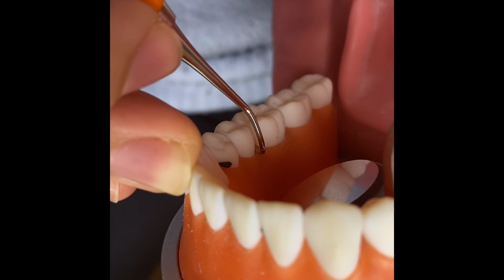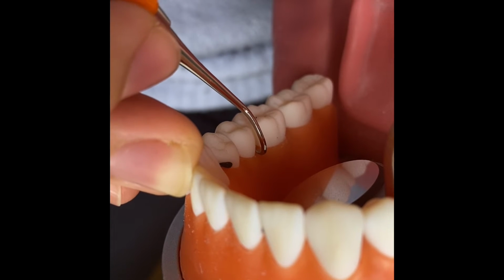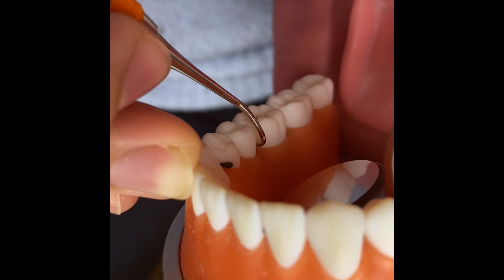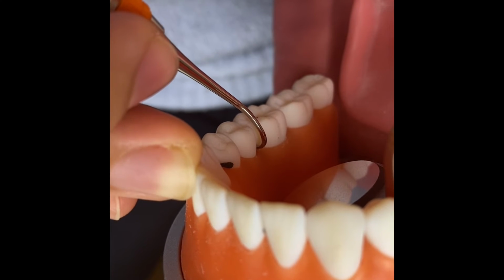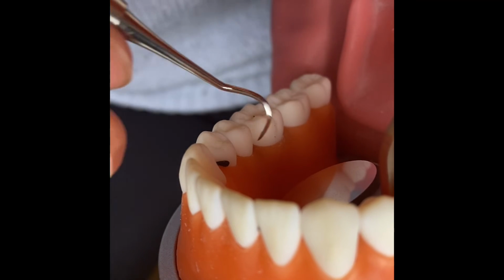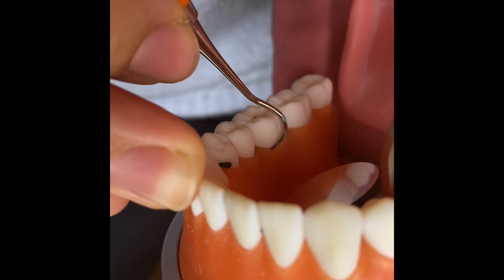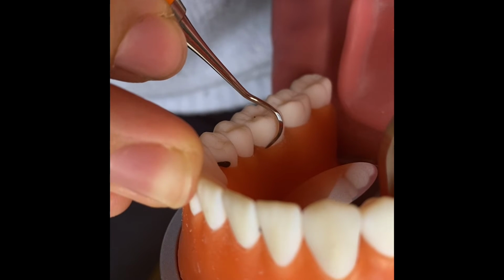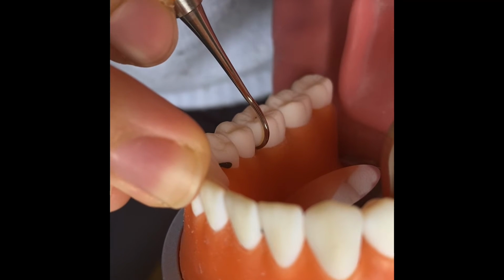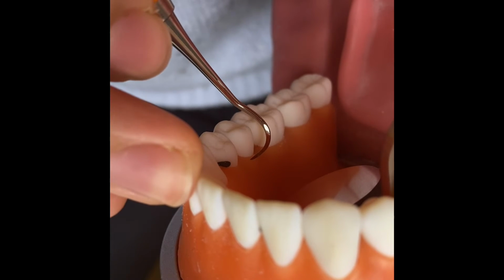starting at distal buccal line angle, sitting at 10 o'clock, side to side, pivot, roll, down, down. Mesiobuccal line angle, up, down, down. Number 29.